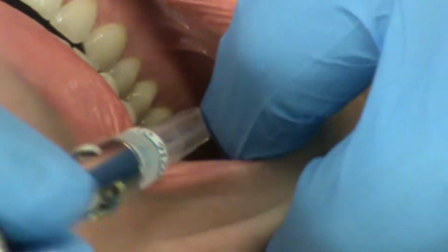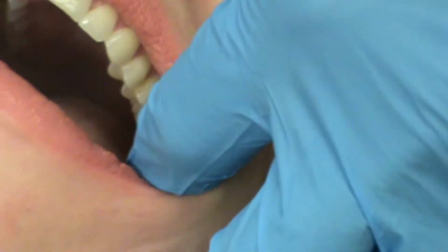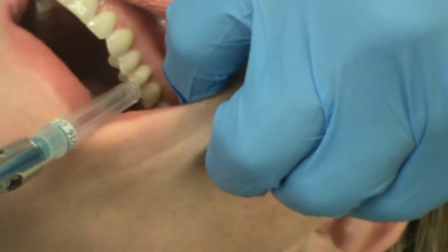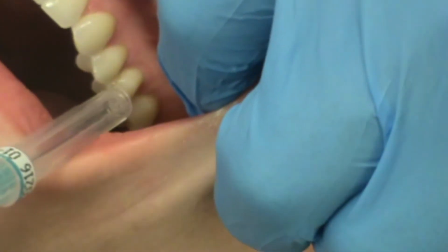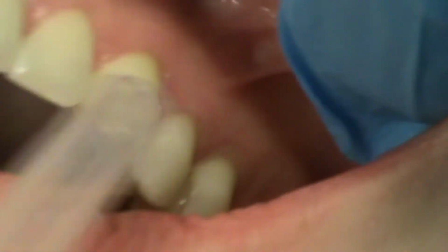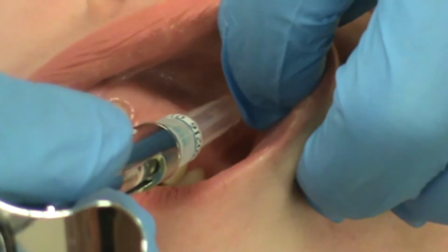Then the next injection, that was the PSA, the next injection is the MSA. The MSA is deposited above the second premolar right here. And the ASA is pretty much above the tip of the canine here.